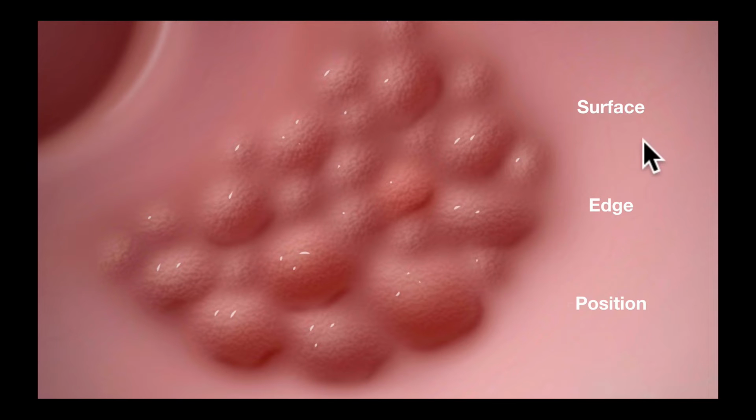When it comes to surface, looking for cancer, you should use preferably a cap-fitted colonoscope, high-definition scope with chromoendoscopy features, and if possible, a near-focus function, and scan the entire surface of the lesion, looking for surface pit pattern and vascular pattern indicative of submucosal cancer.